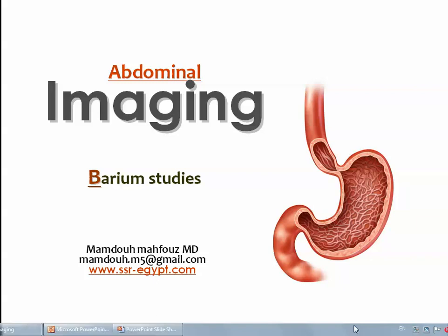Dear colleagues, we are about to continue the series of DRE or Diagnostic Radiology in English, and we started to discuss the gastrointestinal imaging. We have delivered 2 lectures about the normal anatomy. Then we are starting 4 lectures about imaging of the gastrointestinal tract, considering the diagnostic value of barium studies as well as the role of CT and MRI whenever they are needed for the diagnosis.